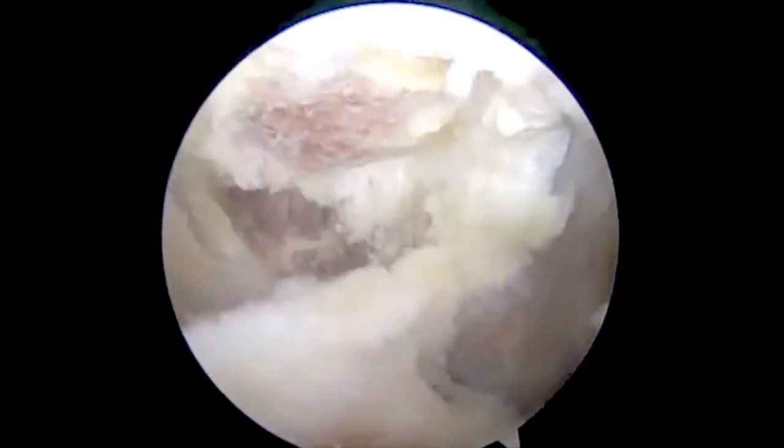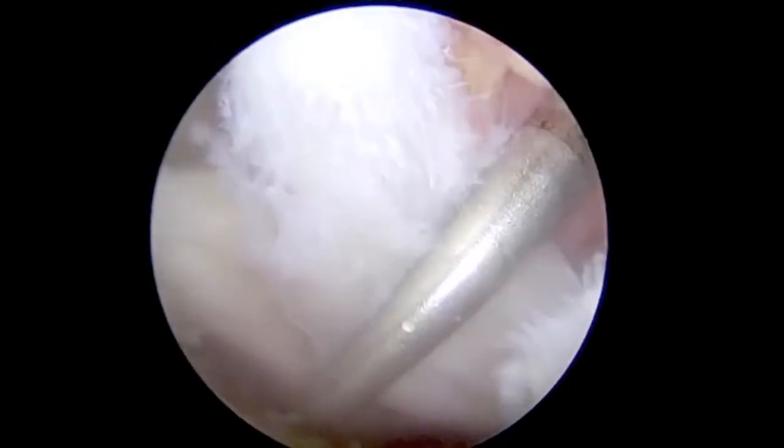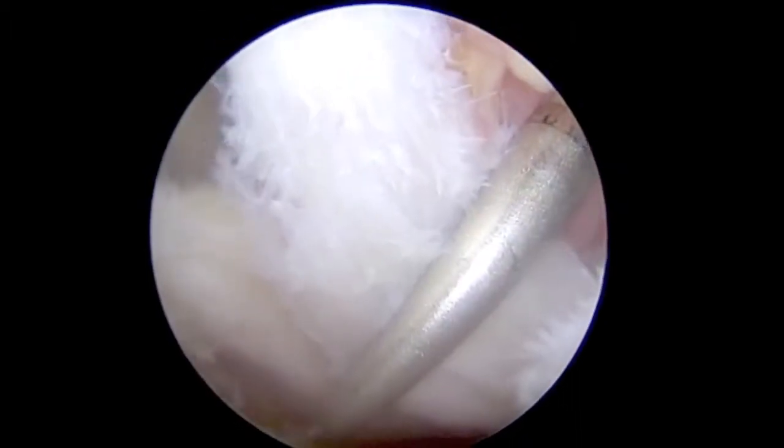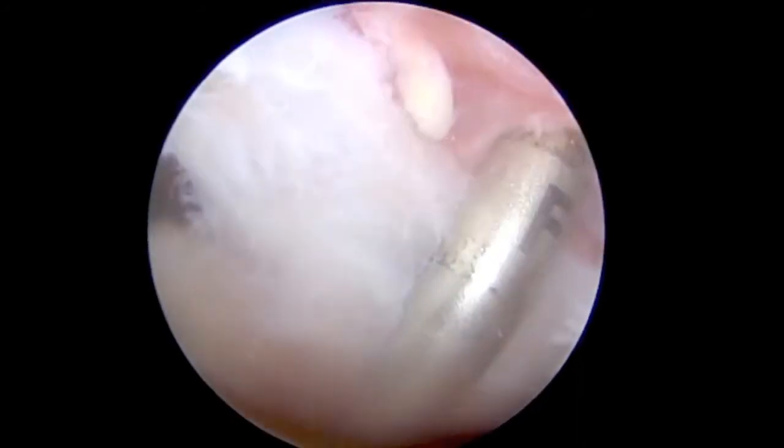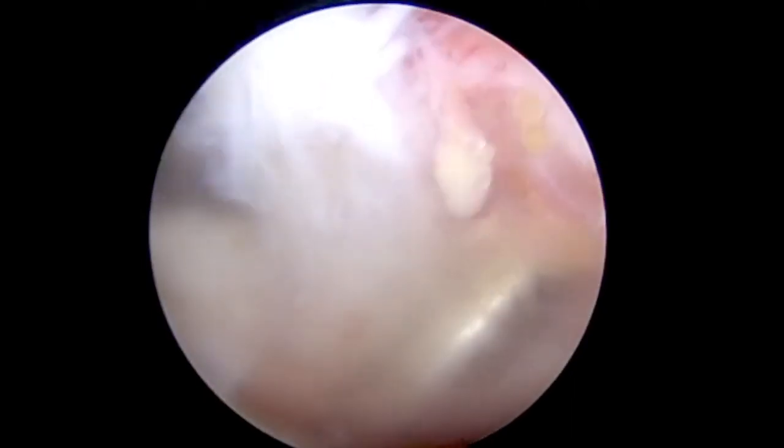An 8mm cannula is inserted through the anterior or an accessory portal to ensure soft tissue bridges are not formed during suture passage. A punch for a 4.75mm swivel lock suture anchor is used to create the hole for anchor placement.